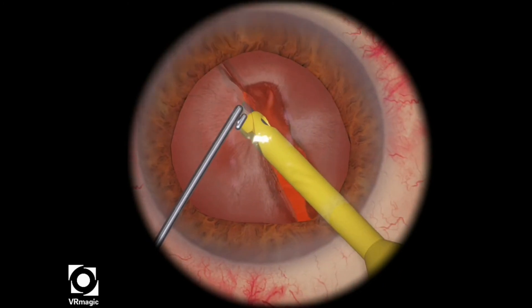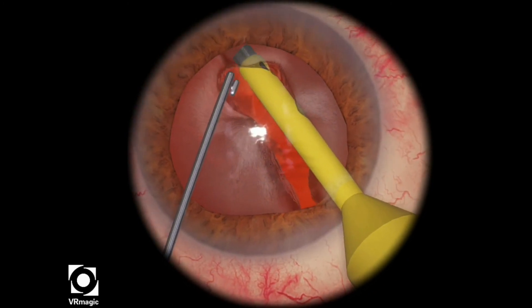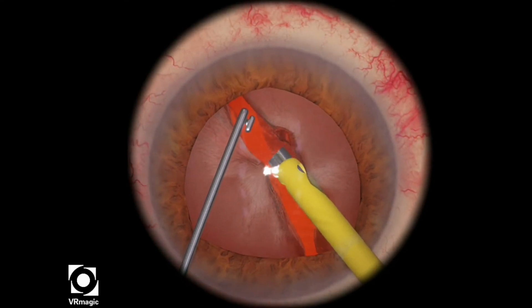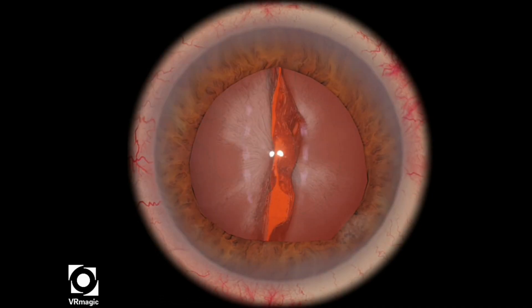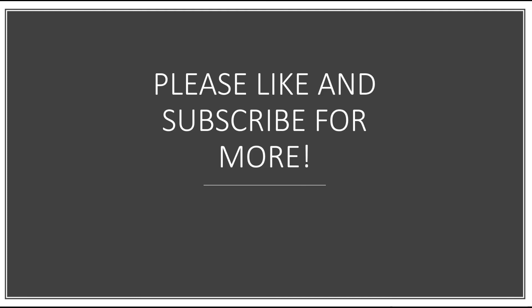Here I'm digging and using way too much ultrasonic energy, at least according to the machine, but then I'm able to propagate the crack. And here I demonstrate that if you pull too far, you're actually going to create a posterior capsular rupture.